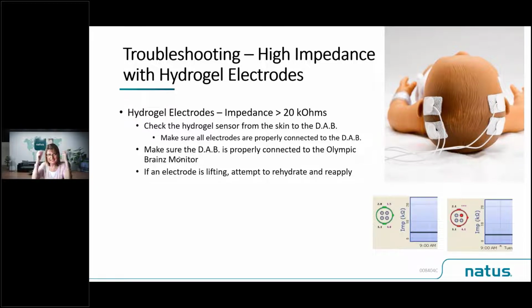If you're using saline and you're really soaking the electrodes and the head, that can cause an ion channel. So think about what sodium is. It's got those positive ions, which are great electricity conductors.